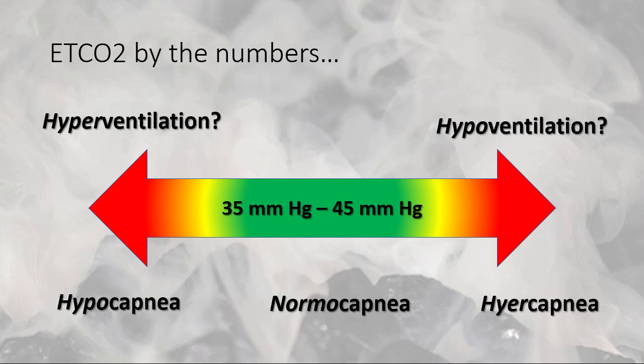In PEs, because of perfusion, if a big clot blocks off your pulmonary capillary circulation and prevents blood flow to huge portions of your pulmonary capillary bed, you can be breathing normally, but your end-tidal CO2 can be in the toilet. So it's really important to understand that while respiratory rate can have an effect on end-tidal CO2, it's only one part of a very multidimensional metabolic process.